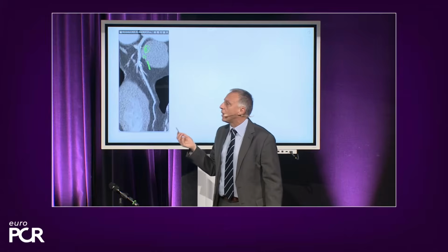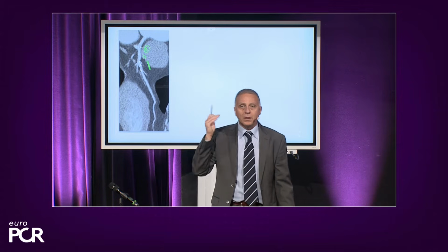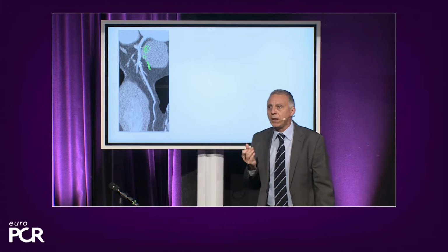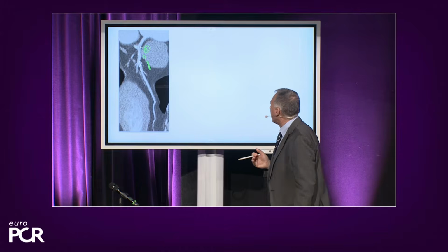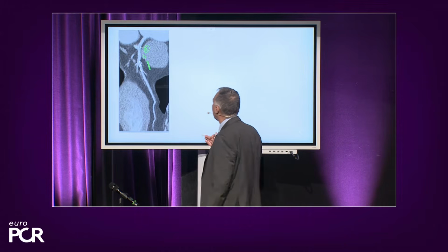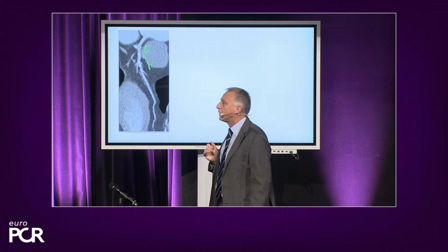So the first question I pose on the basis of these images, that should be in the mind of the operator planning to perform a PCI, is which can be the best strategy when you have in mind this kind of workup done on the basis of CT scan.